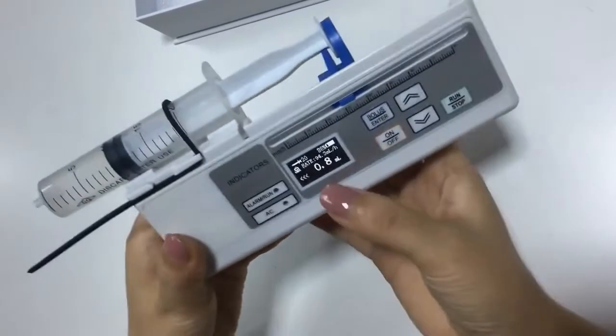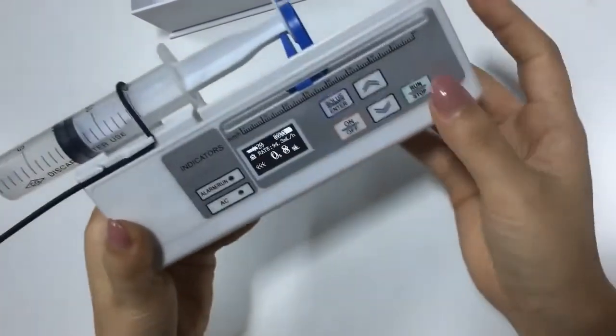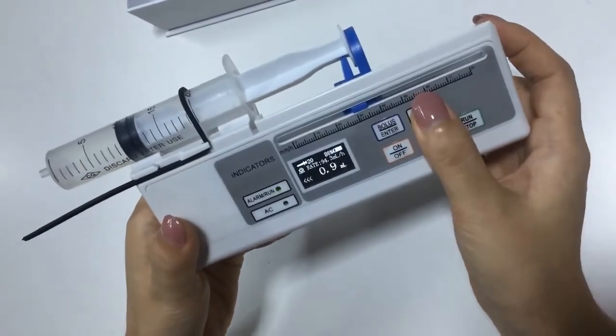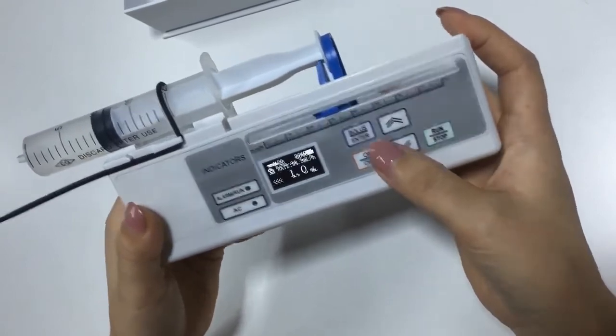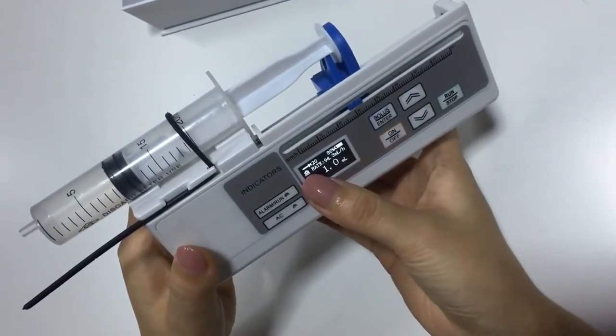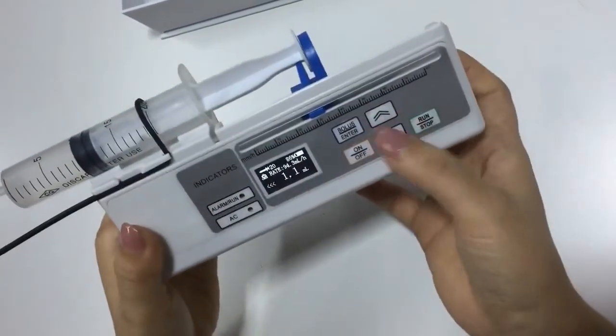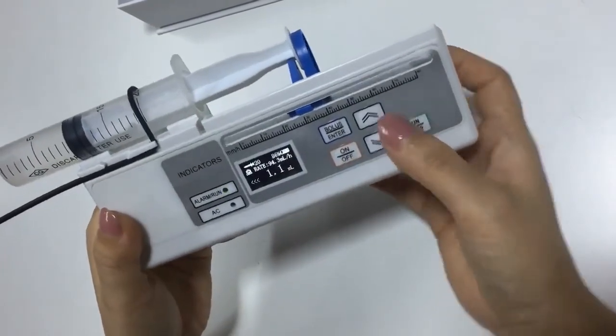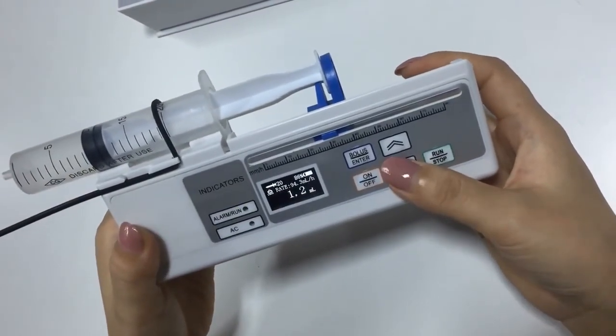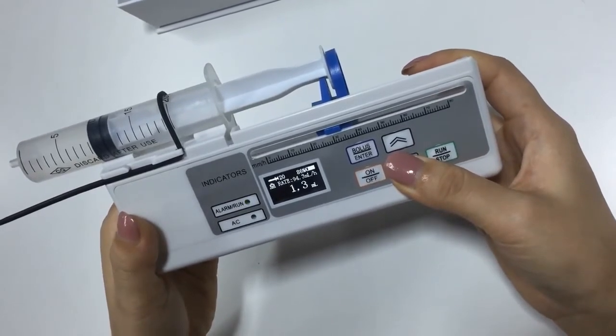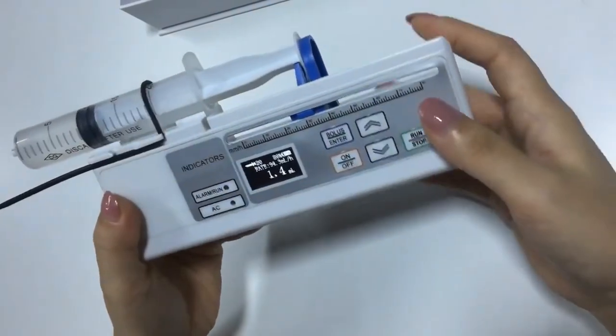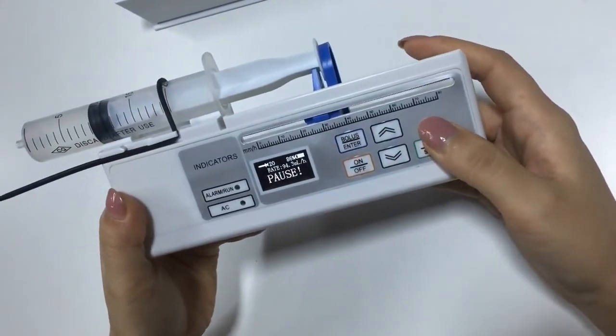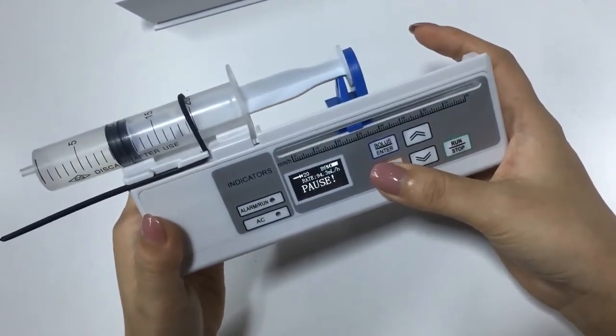Here it shows it's locked, then you cannot change the value. Once it shows up, if you need to change the parameter or stop, press the down key for a while until it is removed, then you can stop or turn off.